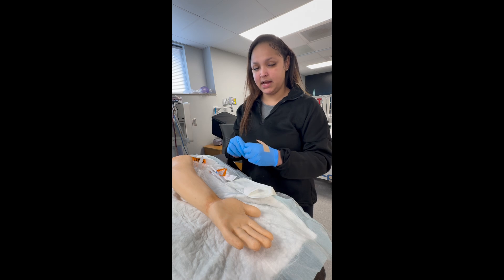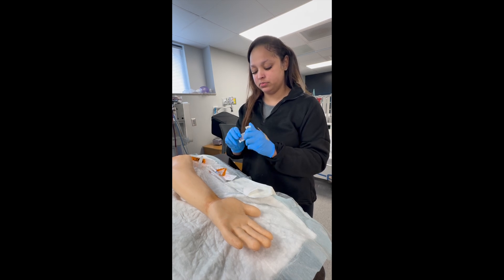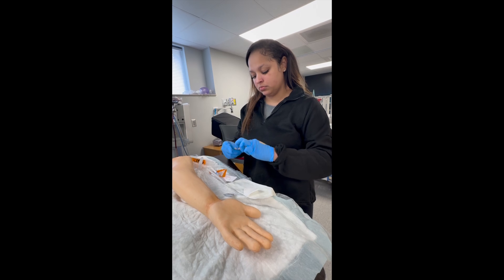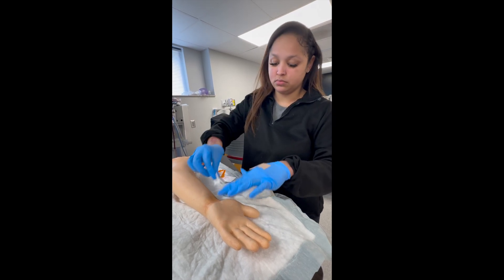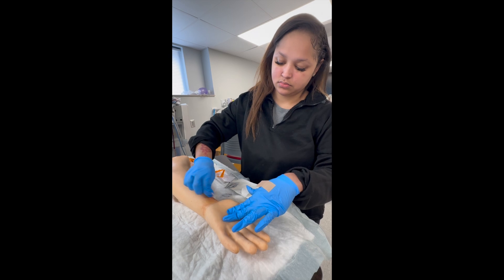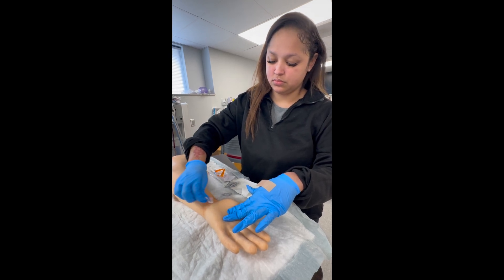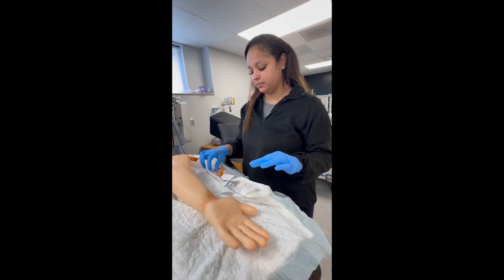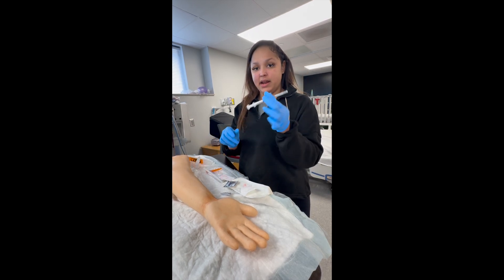First, we'll clean the site with an alcohol prep pad. We'll allow that site a couple of seconds to dry. While that's drying, I'll get my needle.